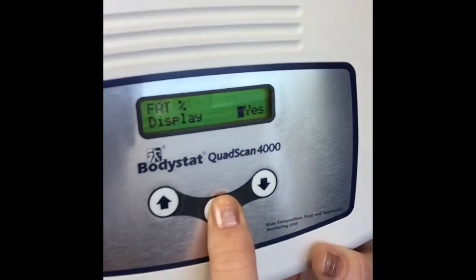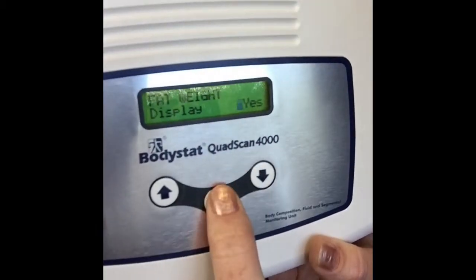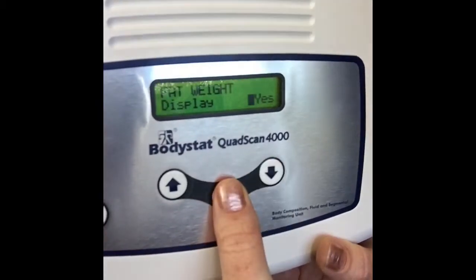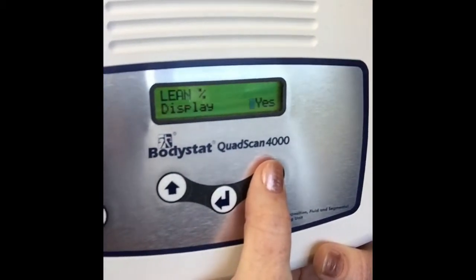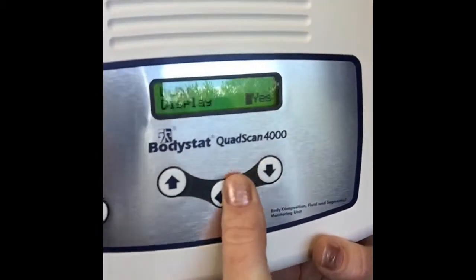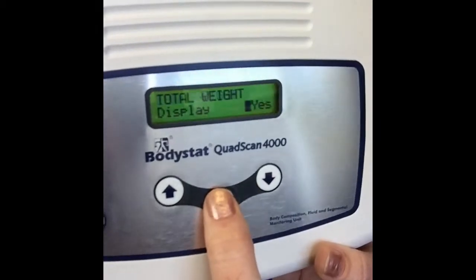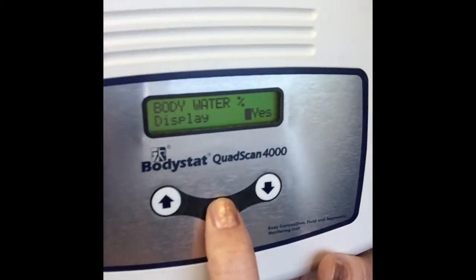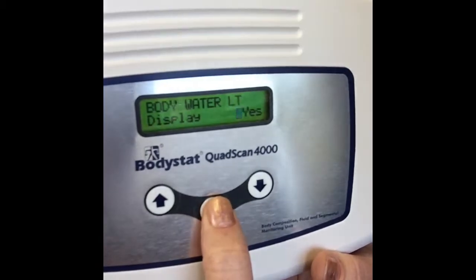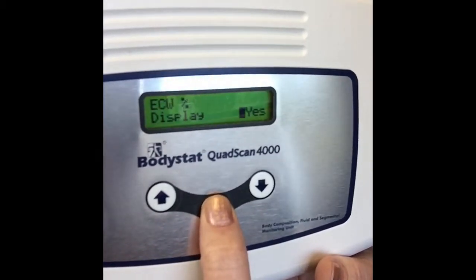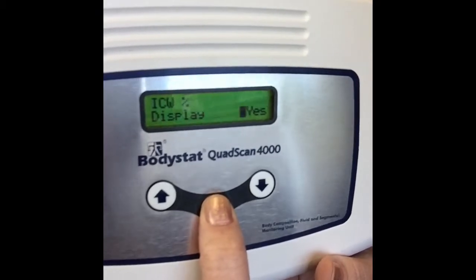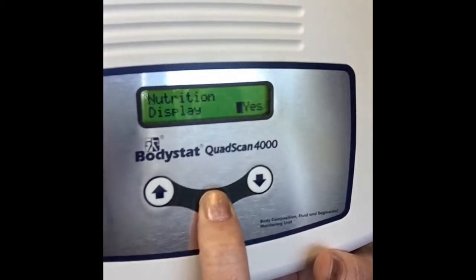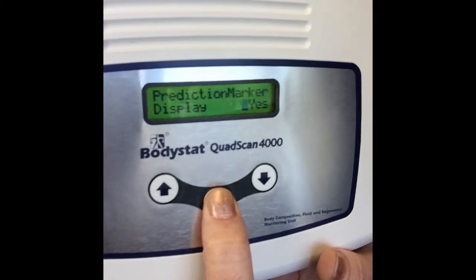Fat percentage has the option of being displayed or not. Likewise fat weight — if you're only interested in the percentage you can turn the weight display off. Your lean percentage can also be turned off if not needed, as well as total body weight, dry lean weight, and all your hydration options if hydration is enabled — total body water as a percentage and in litres, extracellular water, intracellular water, body cell mass, third space water, nutrition index, and your prediction marker.